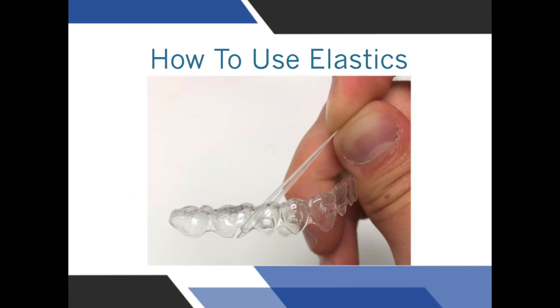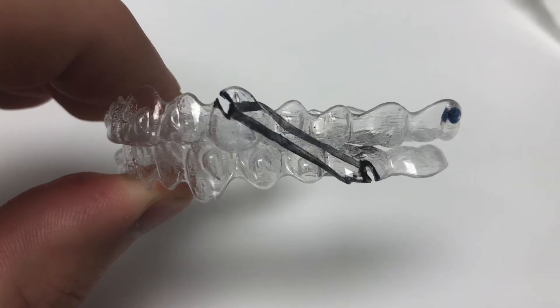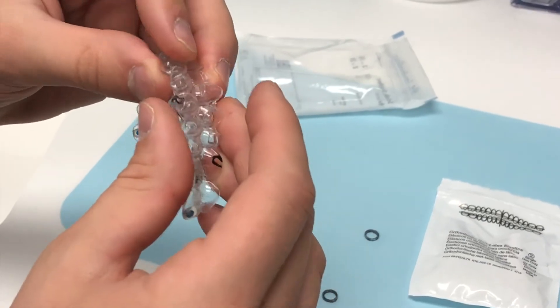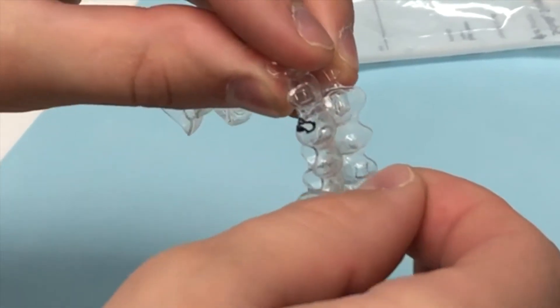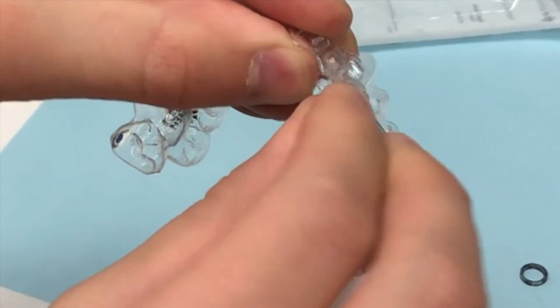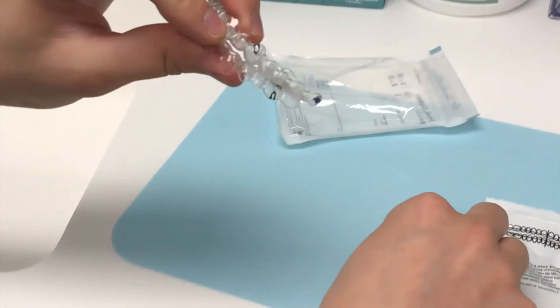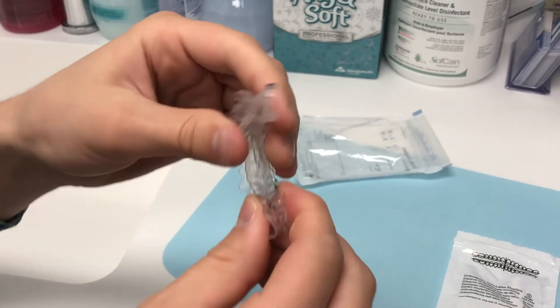Using elastics, once you have the hang of it, is generally pretty easy. The hooks are highlighted with sharpie here to make them easy to see, just like the elastics. To put the elastic onto the trays, take both of the trays and put them together almost like the teeth are biting. Then, taking the elastic, hook it from one tray to the other tray on the little cutouts. Don't let go of the tray or the elastic will cause it to move. Do the exact same thing on the other side. Then, taking the tray like a sandwich, put it in your mouth, press down against your bottom teeth and then bite into it so that it goes on your top teeth as well.